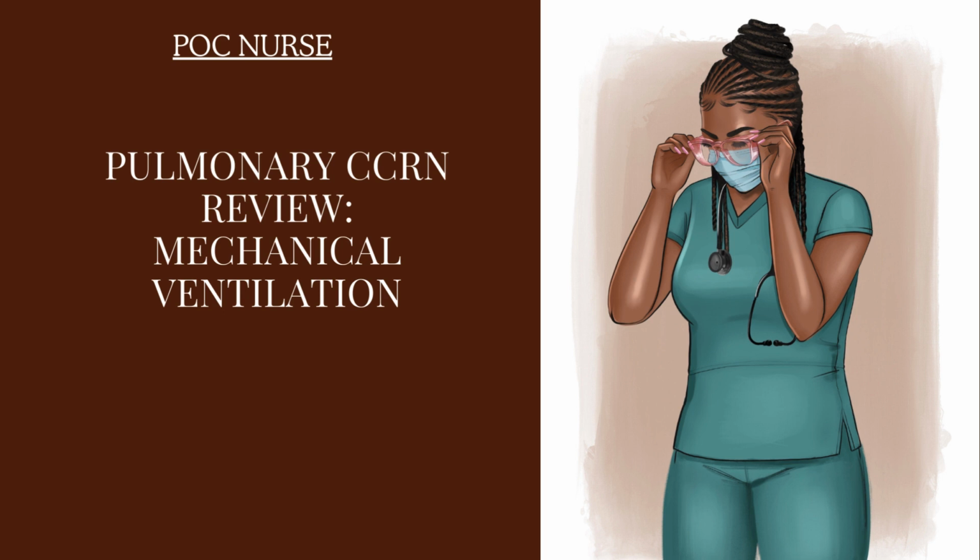So you want to use low tidal volumes so that the patient's lungs don't get hurt, because if you push a lot of air into a non-elastic system, it could pop. So low tidal volumes for the patients with ARDS. Also, we want to try to maintain a normal plateau pressure of less than 30 centimeters of water. The ARDS patient also requires high PEEP, like we said before, between 15 to 20 centimeters of water, so that they can adequately gas exchange and oxygenate.